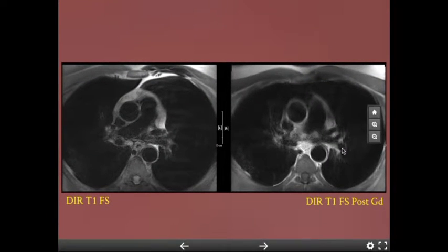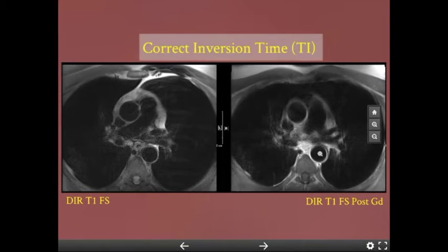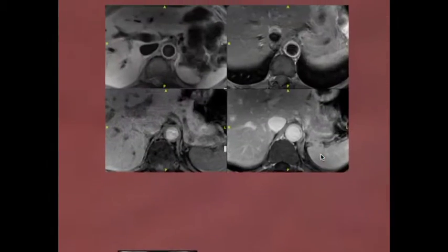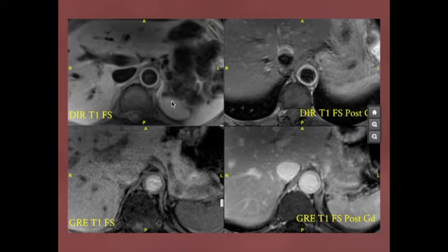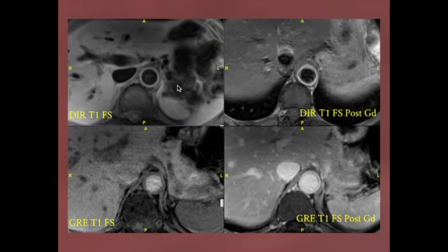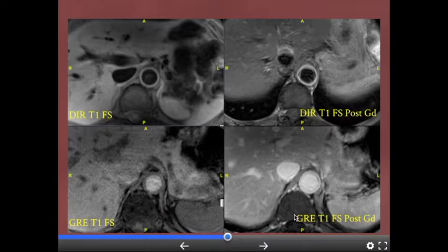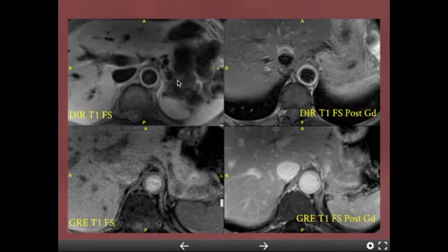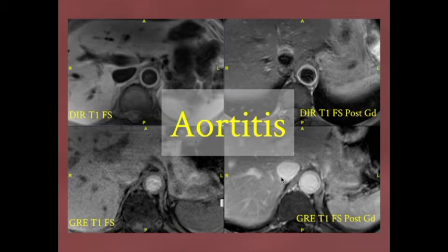Here's a case with correct inversion time post-gad — blood pool is dark. Another case shows DIR T1 with fat sat pre-contrast and post-contrast, where the aortic wall is bright on both, making it confusing. We've moved to gradient echo instead of DIR for aortic wall enhancement: pre-contrast T1 and post-contrast clearly show wall enhancement. This was a case of aortitis — circumferential mural thickening that is almost always aortitis whether enhancing or not. The gradient echo approach gives a more definitive answer.